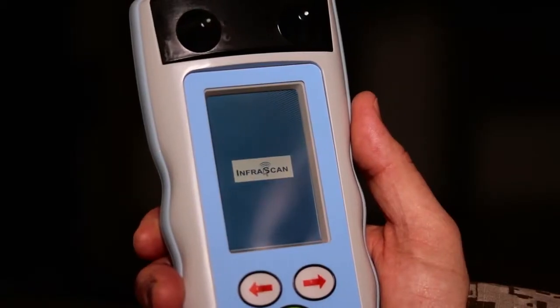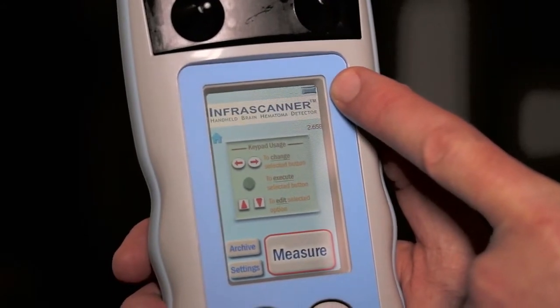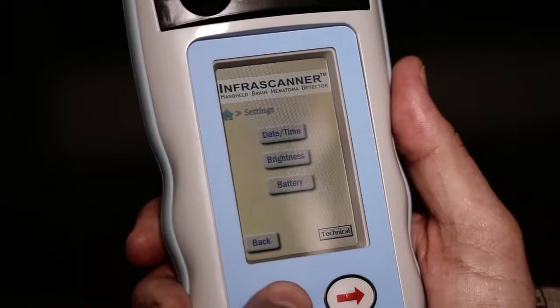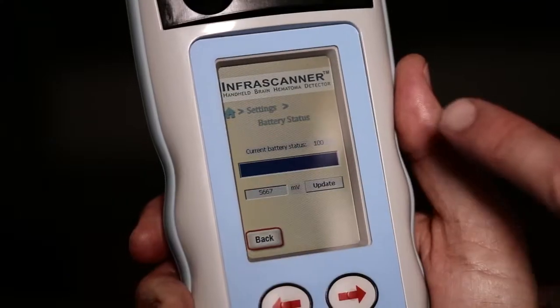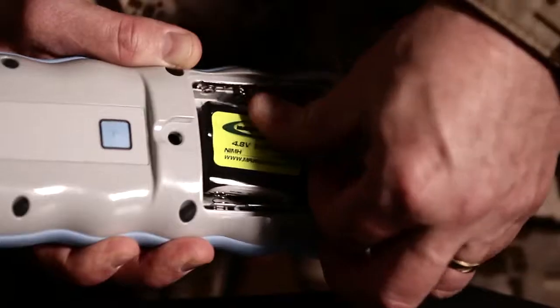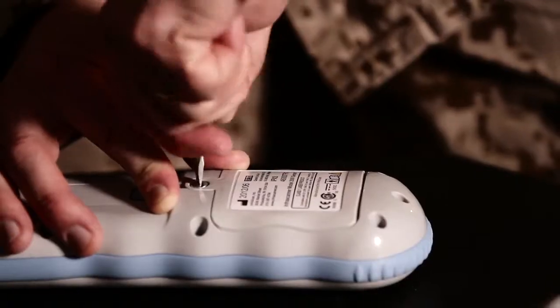The first thing you want to do is make sure the system is fully charged or has fresh AA batteries. The system provides an hour and a half on the rechargeable batteries and up to two hours with AA batteries. The battery indicator light is in the top right of the screen. If you see a low battery indicator, you have approximately one to five scans remaining. You can also navigate to the settings screen for the percentage of battery life remaining.